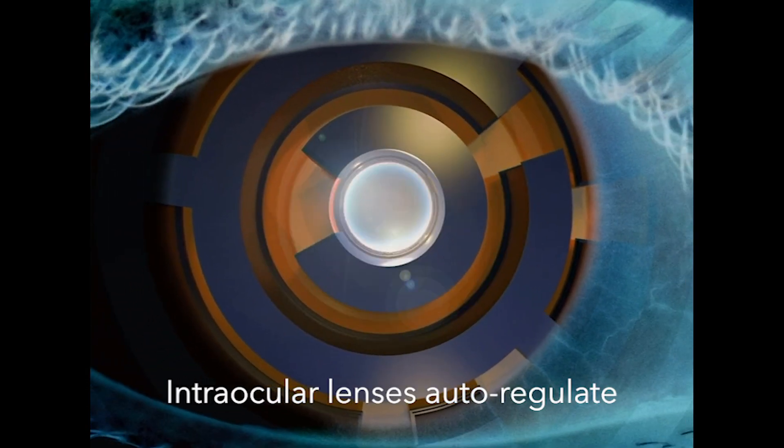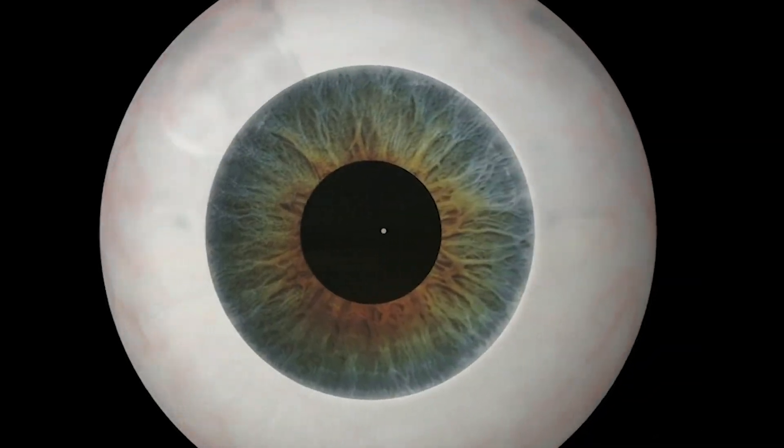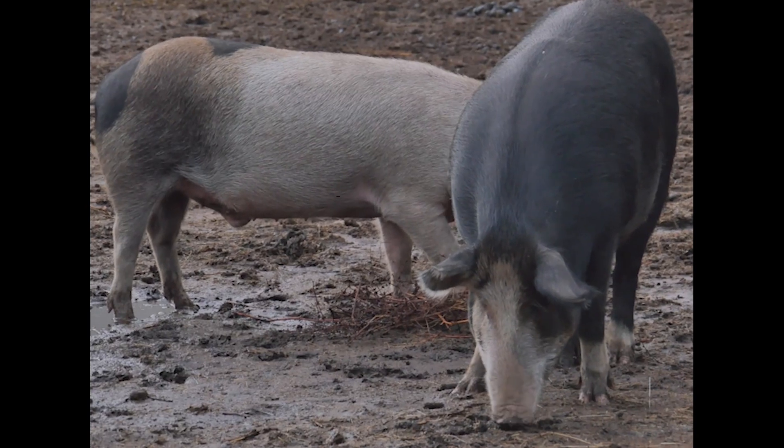It works by intraocular lenses, which have the ability to auto-regulate within the eye, allowing them to focus at different ranges by subtly accounting for optical irregularities in the cornea. They've made it all the way to animal testing, and the pigs are fine.